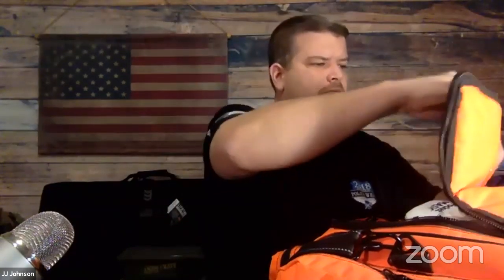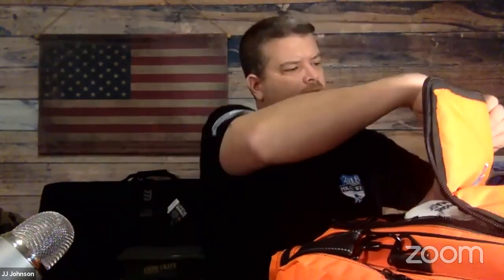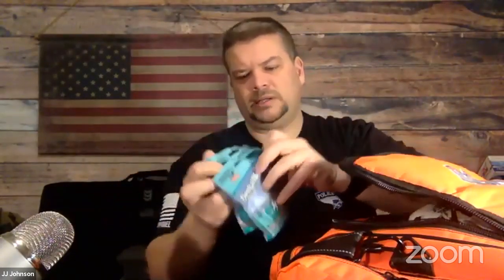I've got a little package of some gloves there. I got those right up front, the gloves, especially because you want to make sure you put those on early on. Okay, down here I've got two of these different Adventure Medical dental medic, basically like temporary dental stuff in case you have a broken tooth or something along those lines. No, the Kraken, I don't have any O2.